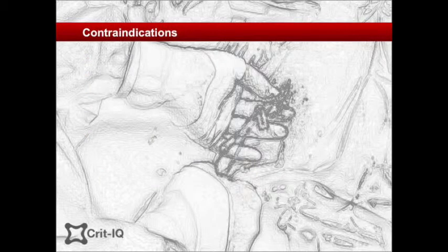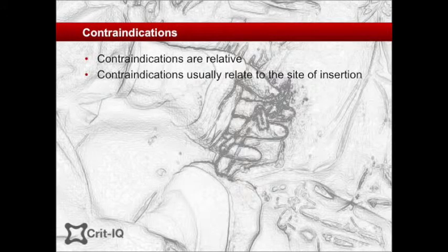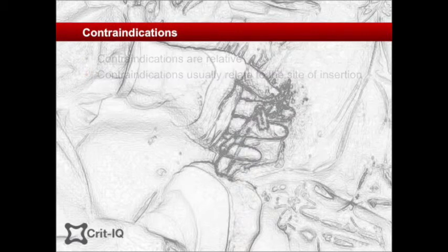Contraindications to CVL placement. Contraindications are generally relative and site-specific. In the critically ill, the presence of a relative contraindication usually points towards a preferred site of insertion, rather than negating the need for central venous access altogether. The main contraindications are coagulopathy, insertion site, or vascular abnormality.